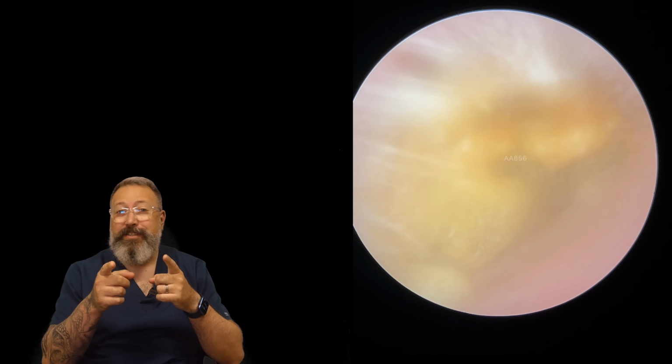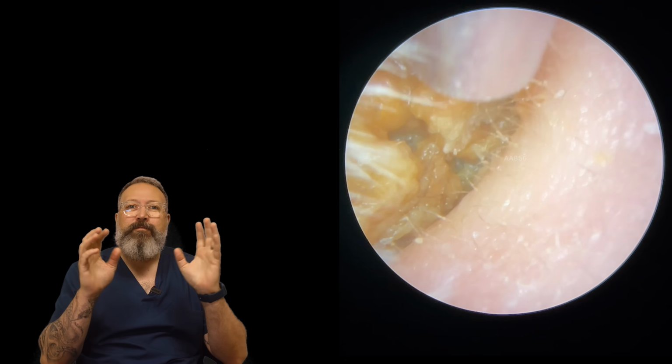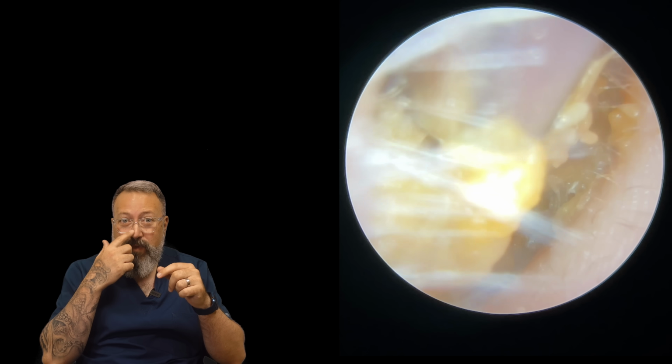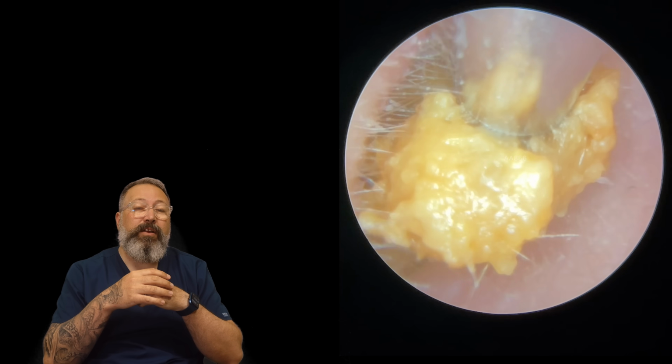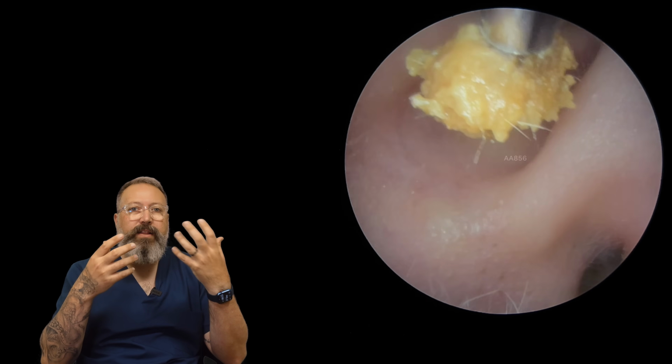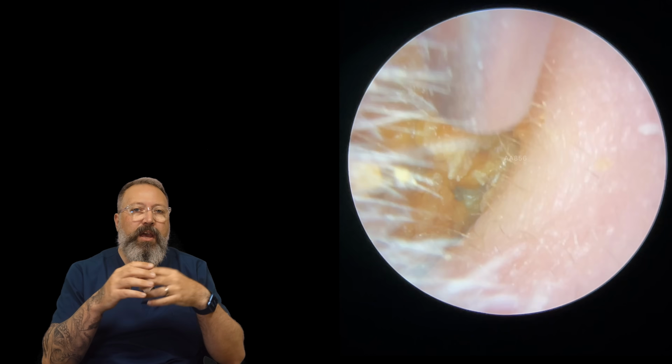We got a great one for you today. Now this is a tale of very different ear canals. Same patient, so we'll see this first ear canal here. Patient came through complaining of lots of issues as far as hearing is concerned. If they get their ears wet, they can't hear for ages afterwards. And you can see why.